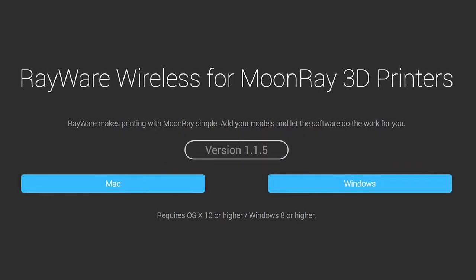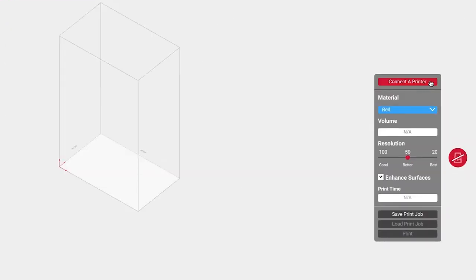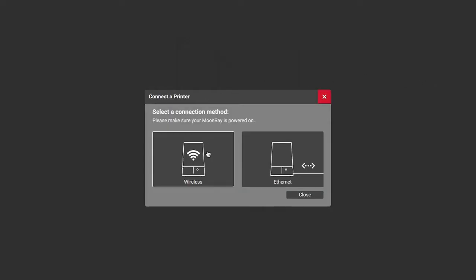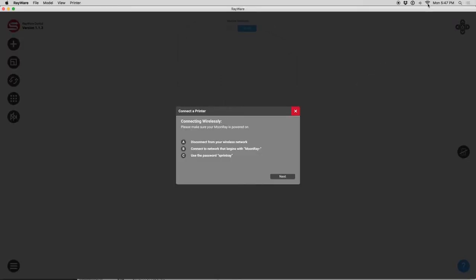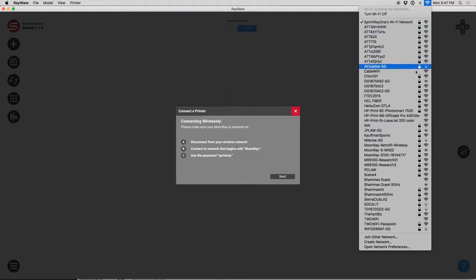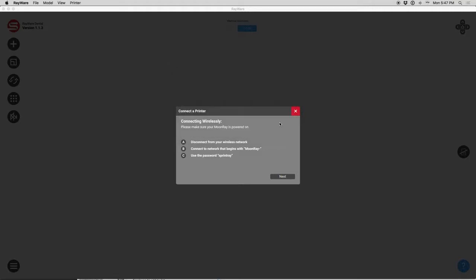Download the latest version of Rayware at sprintray.com/download. You'll find the Connect to Printer option by clicking the Moonray button. Choose between wireless printing or printing via Ethernet. For most users, we recommend printing via your wireless network. Follow the on-screen instructions to connect to your Moonray's network. After entering the password, Rayware will look for your Moonray. This may take up to 30 seconds.